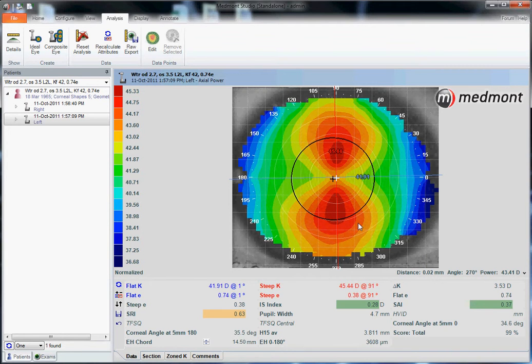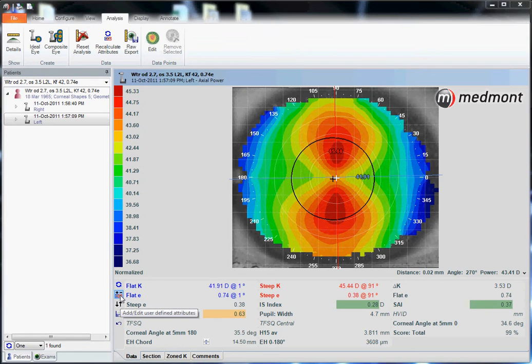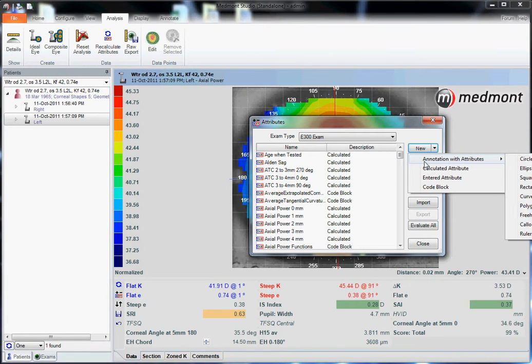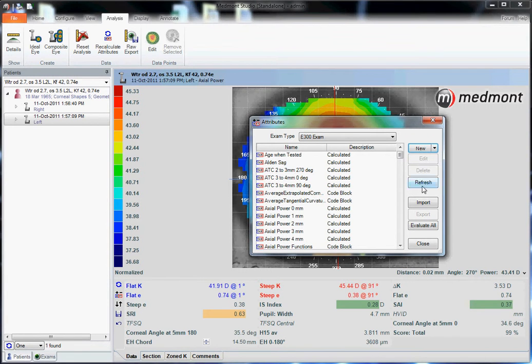If you want to calculate your own formulas, go to the Add/Edit icon and you can create your own analysis options here. If your distributor has sent you a specific attribute to import, you can click on the Import button here.